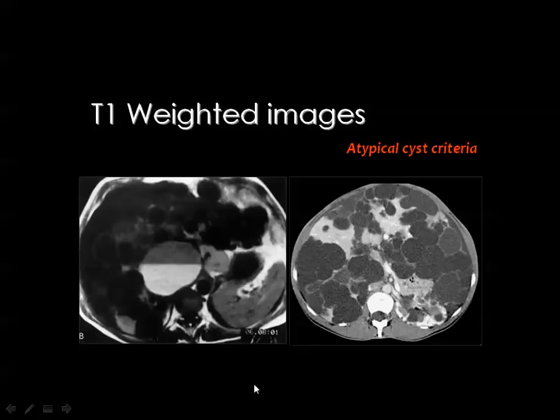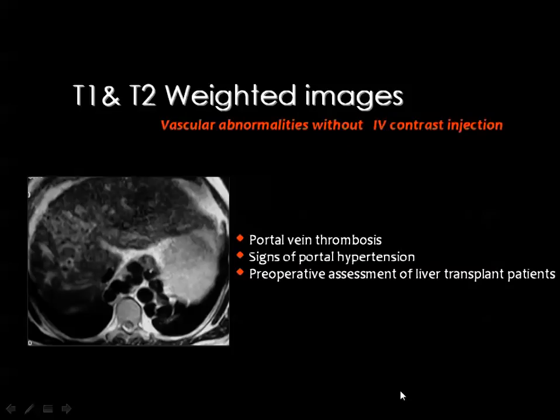explain the patient complaint. You know that a patient with polycystic disease of the liver may be asymptomatic and suddenly develops a severe abdominal pain, and this pain is related to recent hemorrhage inside one of the cysts. And if the hemorrhage is recent, it can be seen by CT, but if it is relatively old, it can be seen by MRI. Then if you are not able to inject the patient with contrast in CT scan examination, you can assess the vascularity using the MR images or MR angiographic images.